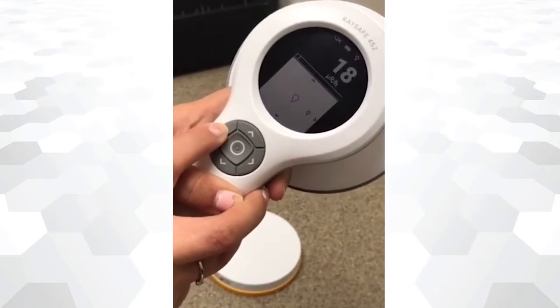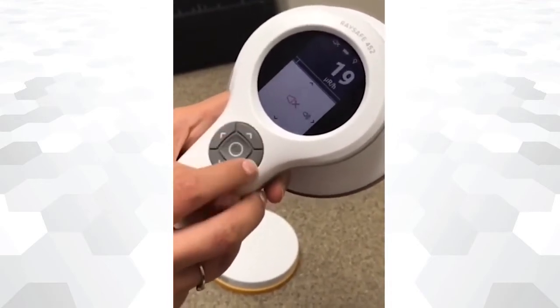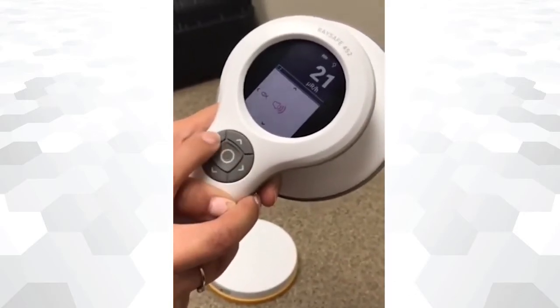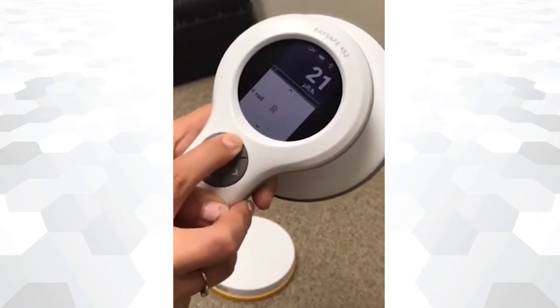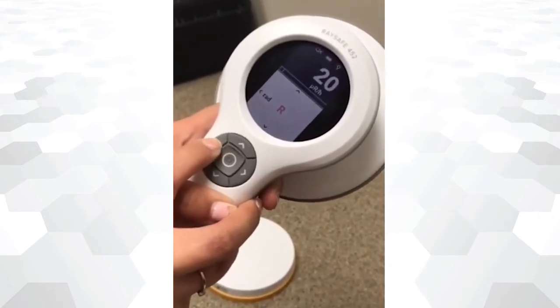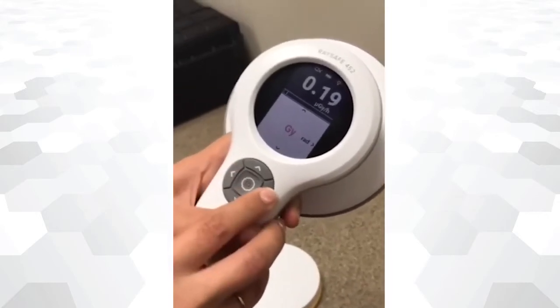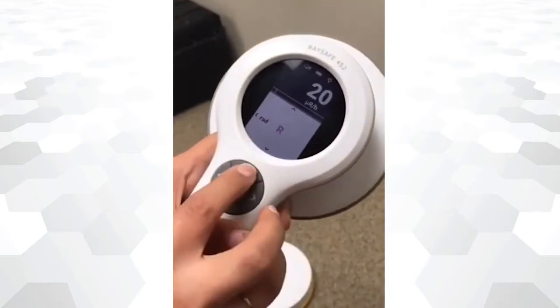To change the screen light settings, press the upper arrow button and select the brightness desired. Press the upper arrow again to change the auto settings. Units are changed by pressing once again the upper arrow. Select the unit that better suits your radiation measurement.